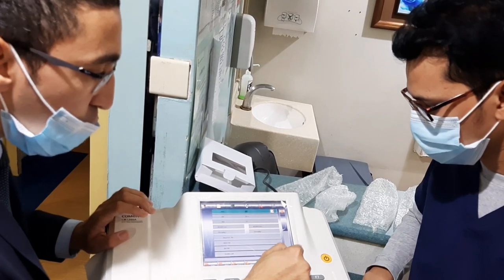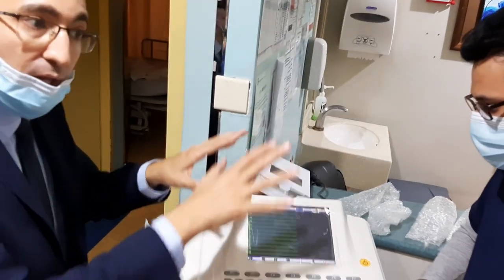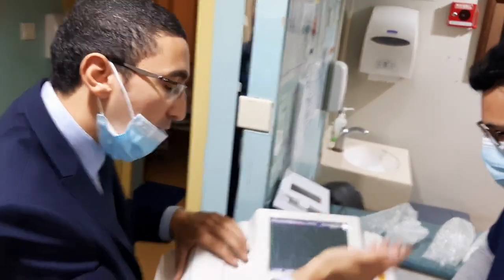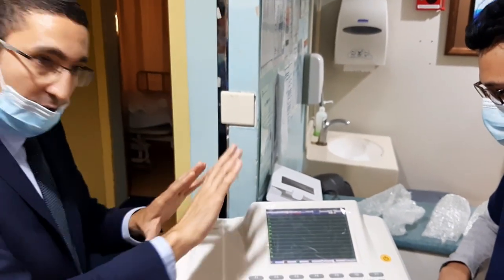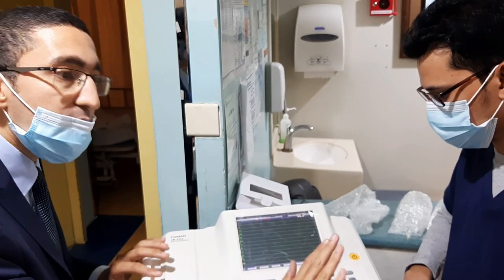Okay? So go back. Like I told you, that second step or the third step, it will be to enter the data observation. So yeah. It will be saved, okay? What is next? Now you connected the cables. It's clear, you are seeing it's all green. You enter the data observation, so you are ready to print.